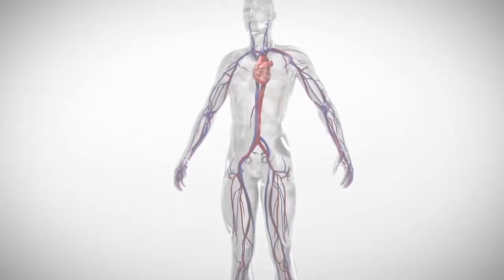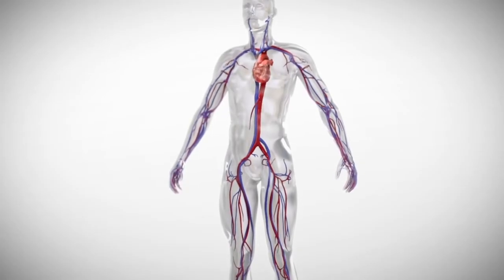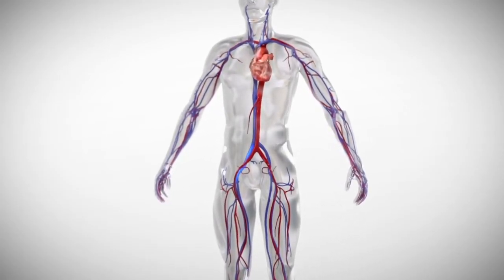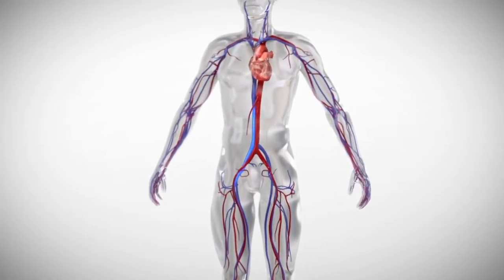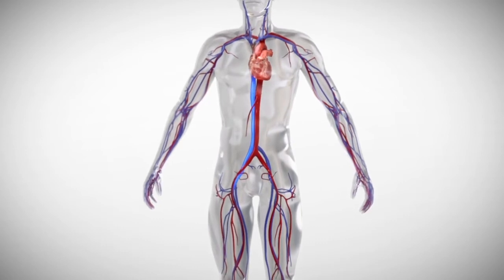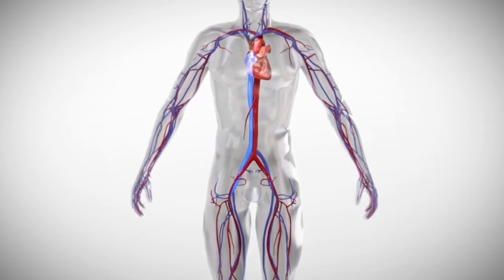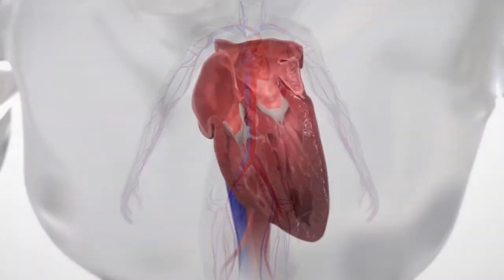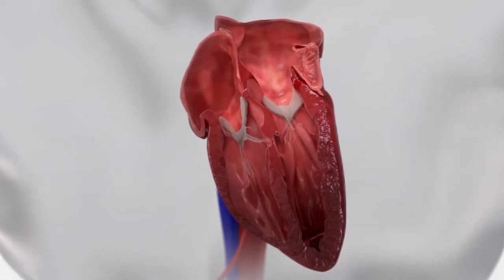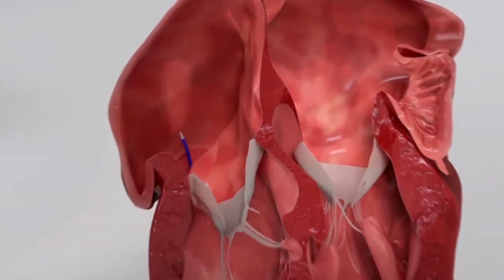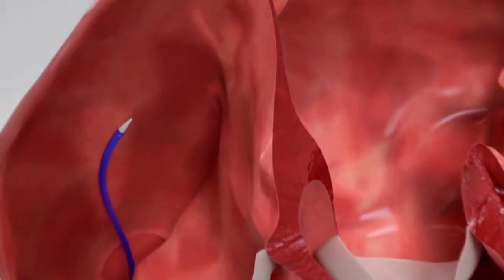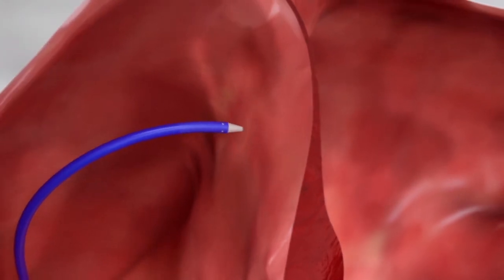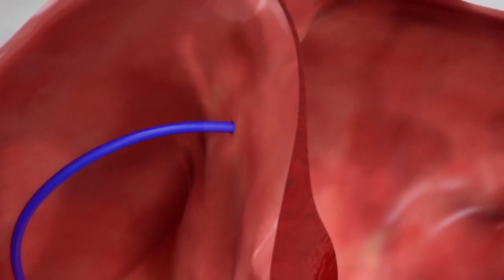The device is placed by an interventional cardiologist using a small tube called a catheter that is inserted into a blood vessel in the groin area and advanced over a guide wire into the heart. The catheter is used to create a very small opening in the heart wall between the left and right atria.